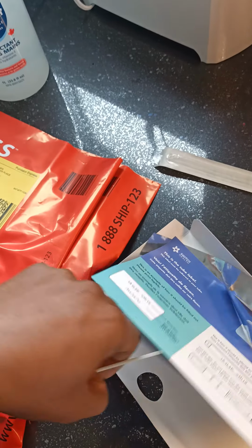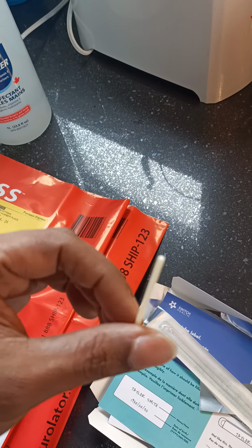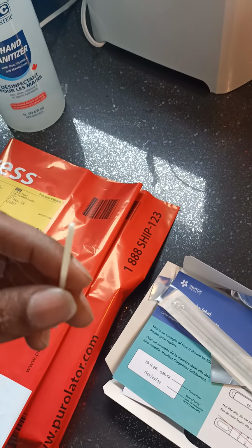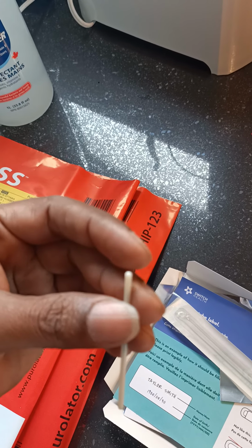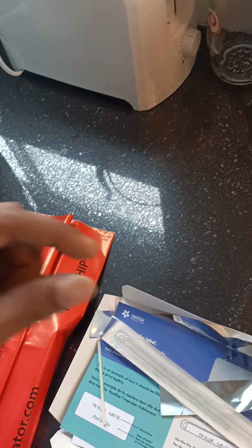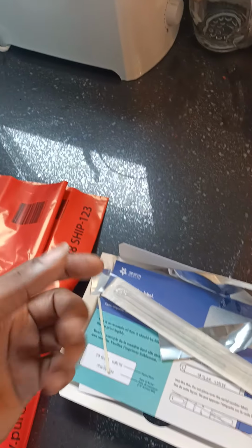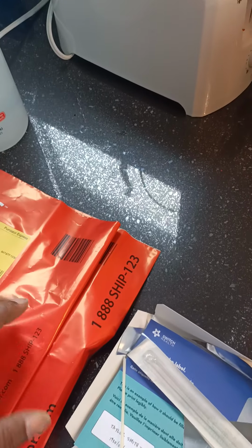For one nostril, it will take around 15 seconds. They will count for us, and for all that 15 seconds we have to keep rotating it inside our nostril, and then we switch to the other nostril and do the same thing. Once we remove it, we have to break it off at the thicker portion, the behind portion. Then the brush we put inside the test tube and close it. Once we close it, there is a biohazard packet. We put it inside the biohazard packet, and there is a tissue to wipe clean and sanitize the biohazard packet.